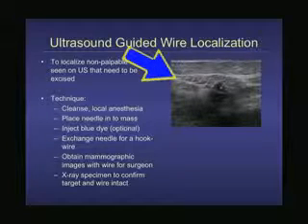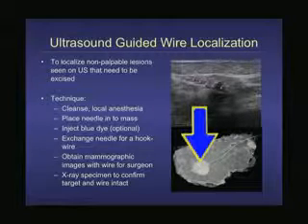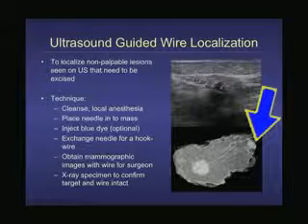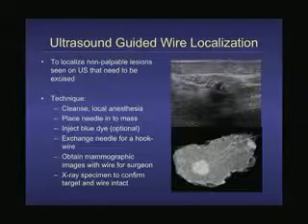There's the little wire going in. It's very, very skinny, so it's harder to see. But here this confirms, again, that was that same woman that had that cancer that looked like a sunburst, and the wire's intact, and she actually had a positive node that was draining to the skin, and so they were able to take all of that out because they couldn't feel that lesion. It was so deep, and she had such a large fatty breast.